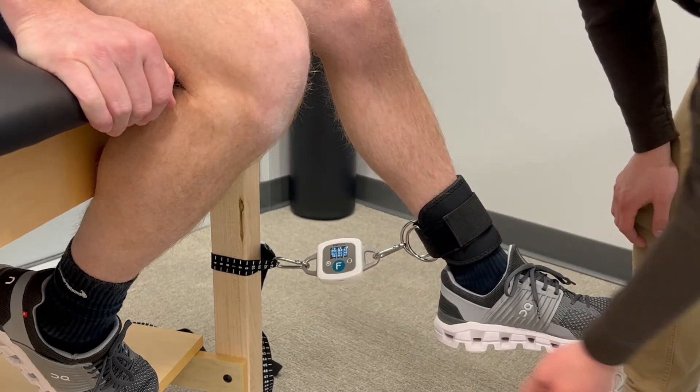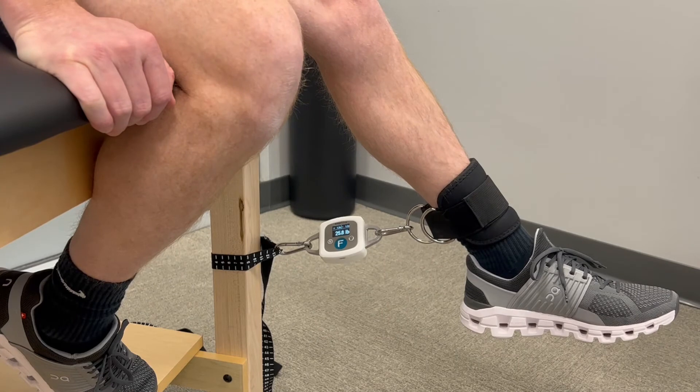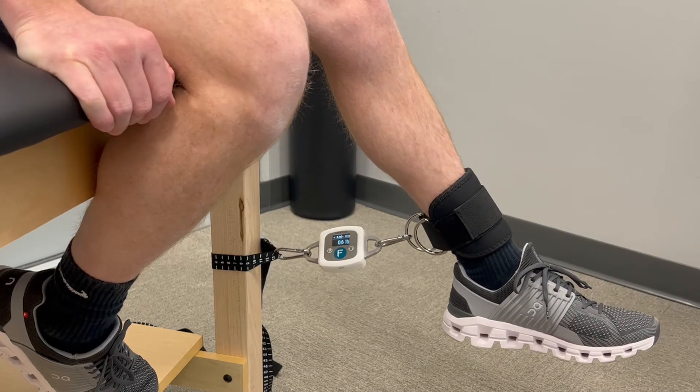Some of our PTs have actually been using this as an exercise tool as well. For instance, after a knee replacement, they wanted to work more on quad strength and help strengthen that muscle. They set up the Easy Force and had the patient perform isometric contractions to a certain pounds of force for a set number of reps, and they were very pleased with the results.